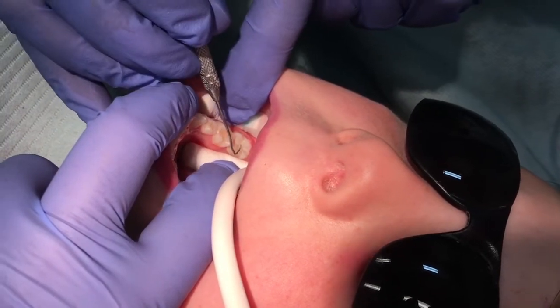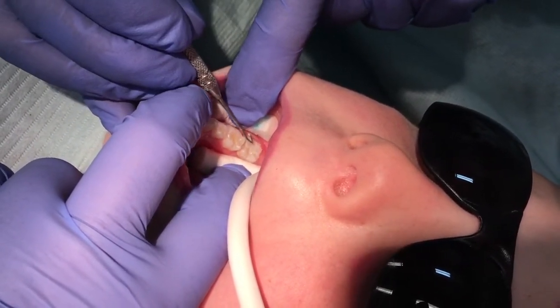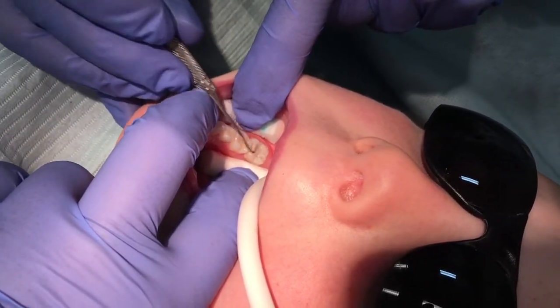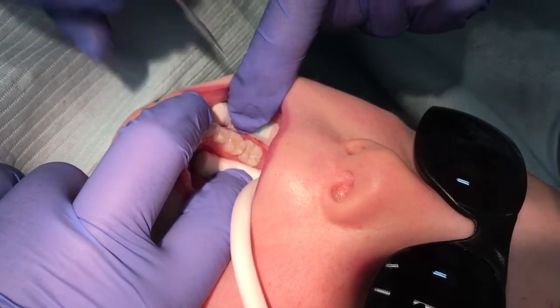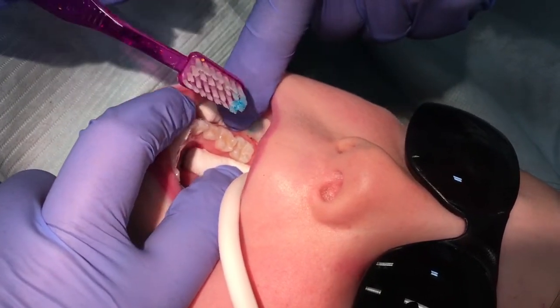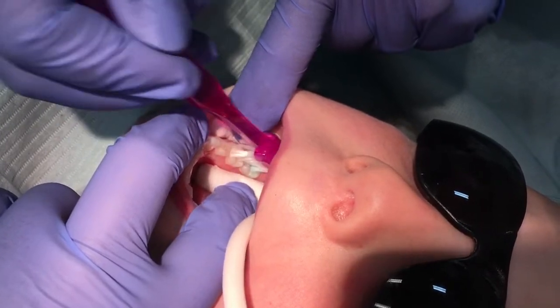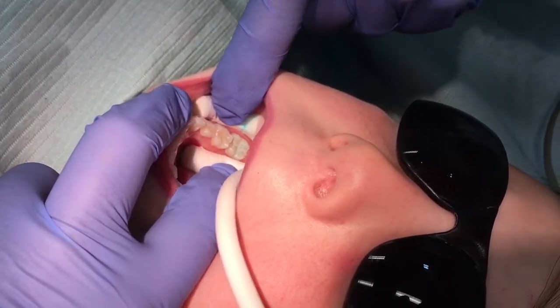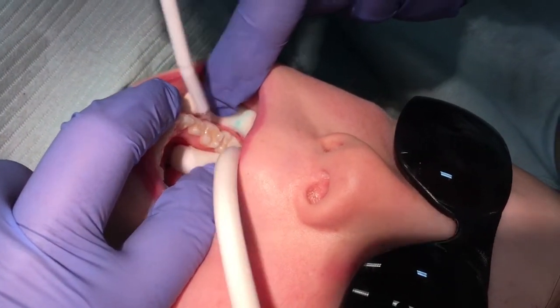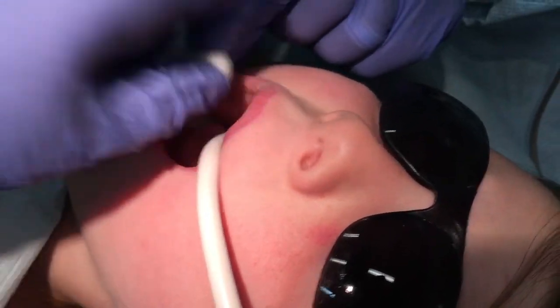After curing, use an explorer to evaluate the sealant for retention. Remove any residual flashing. Check for bubbles — it is really only necessary to add sealant material if the bubbles are at the margin of the sealant. Brush with a smear of toothpaste to remove the bisphenol A. Even though the sealant manufacturer may list only bis-GMA or DMA as ingredients, the American Dental Association says that BPA is still likely to be present in trace amounts. Using a smear of toothpaste will also remove any residual bad taste for your patient.